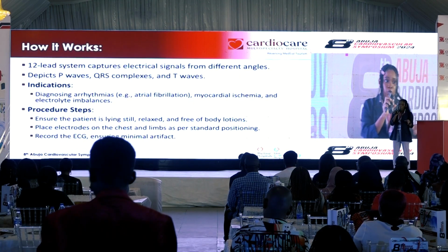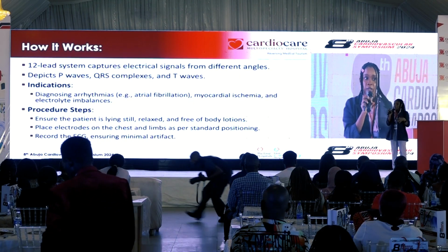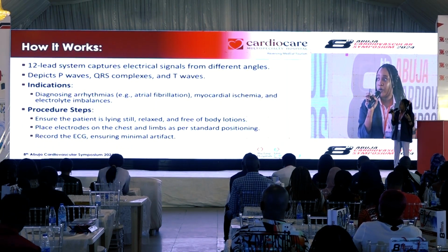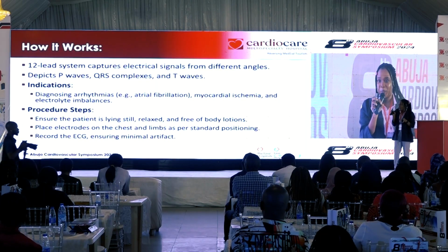So how the procedure works. First and foremost, when they come in, you explain what the procedure is to them. You tell them what to expect. Some people are already very scared, so you try to relax them and tell them, this test is not painful, and it will take up to 5 minutes. I think the ECG strip runs for just 1 minute.